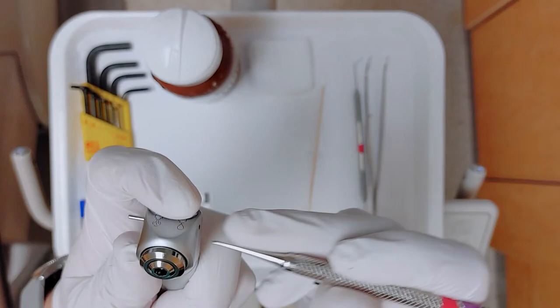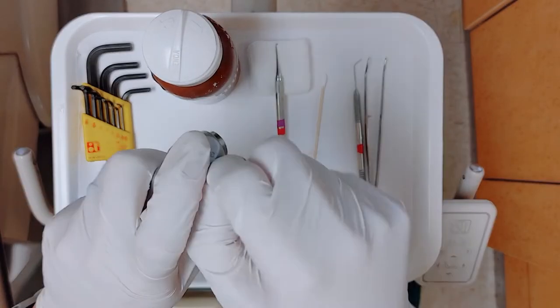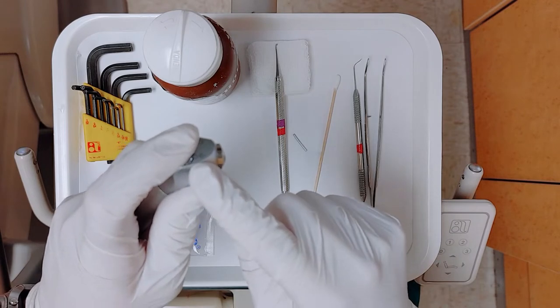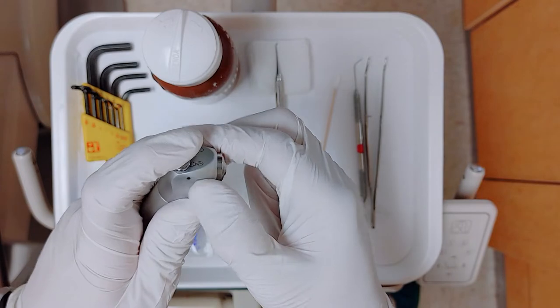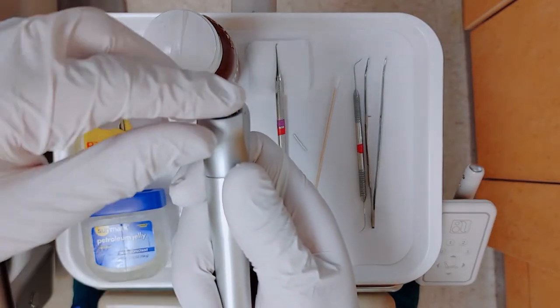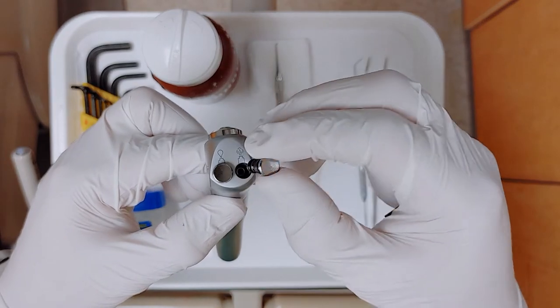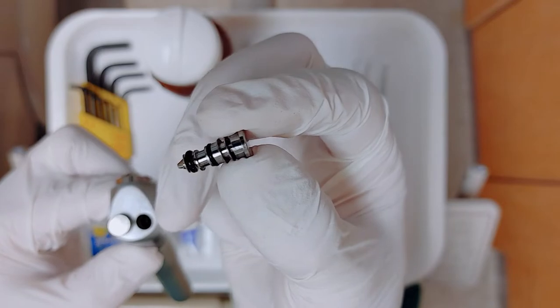So I'm just going to push down on these buttons and push this pin out one side, and you can take it with your fingers or maybe even a cotton plier to remove the rest. Now, like I mentioned, the spring in here is going to make these shoot up. Always keep track of these springs. So as I slowly lift up on this, I can slowly pull each one of these buttons out of place. Right now I have my air button that I'm going to pull and remove, and you'll see all the different O-rings and pieces to this button.